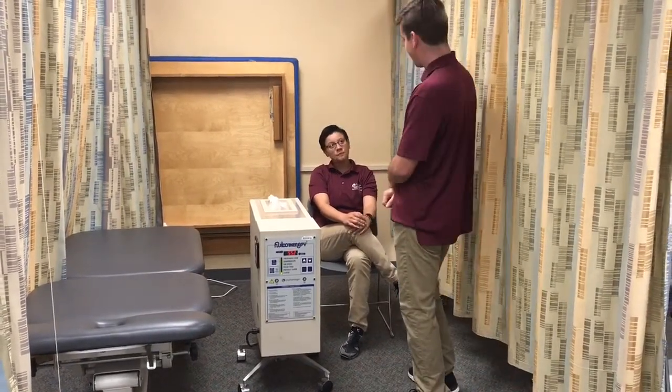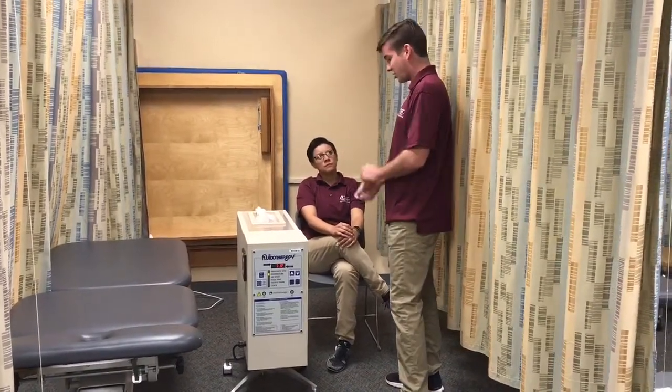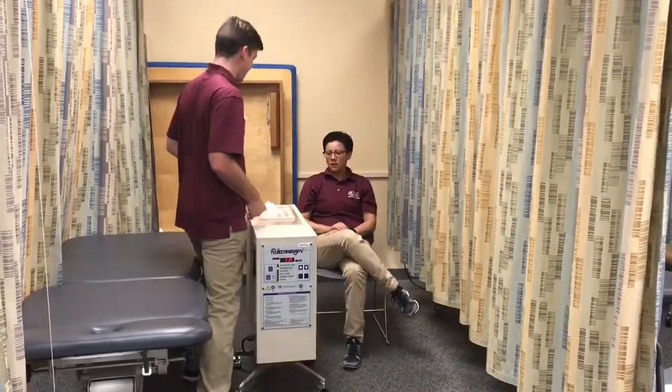We're going to keep the temperature at 118 degrees Fahrenheit and the velocity will be at 100, which will help you do some range of motion exercises during the treatment. The treatment time will be about 20 minutes, and I'll be back within five minutes to check on how you're doing.